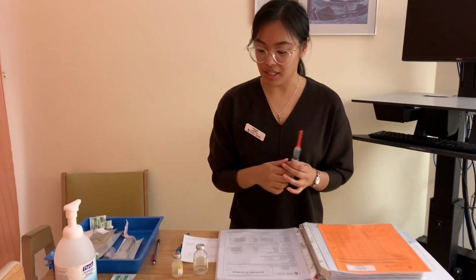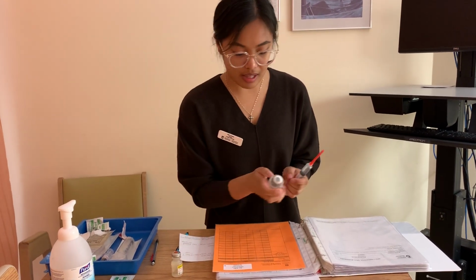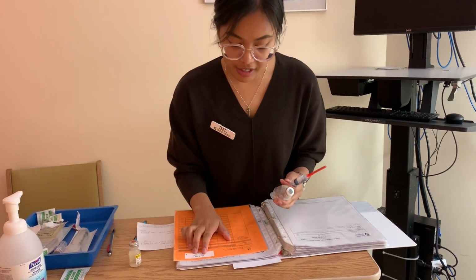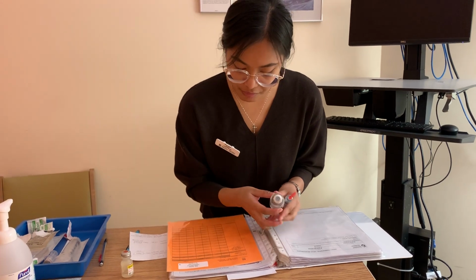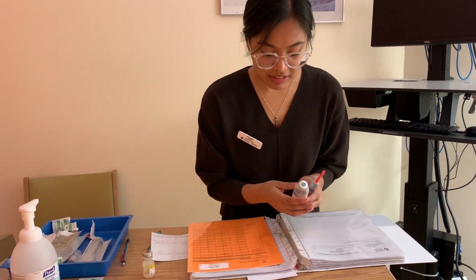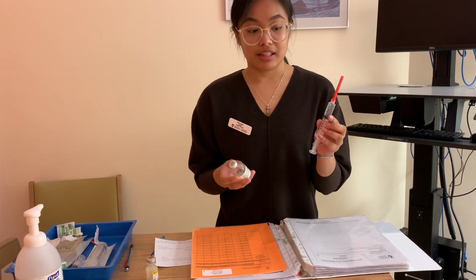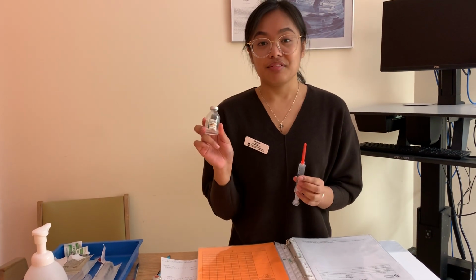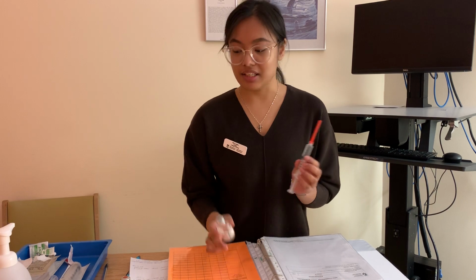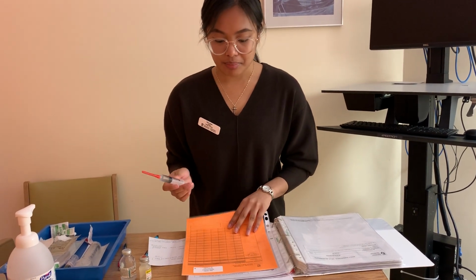Now I'm going to do my second med check with my MAR medication and my syringe. So here I have Erica. It's for Erica. I already confirmed when I reviewed with my MAR earlier. And right medication, Penicillin G. I have the right dosage of 2.5 million units, which I calculated to be 5 mLs from the vial. Right route is IV. It does say I can give it IV from the vial, so I can give that. And right time frequency is every 6 hours. It hasn't been given yet, so I can give that right now. Okay, so I finished doing my second med check.